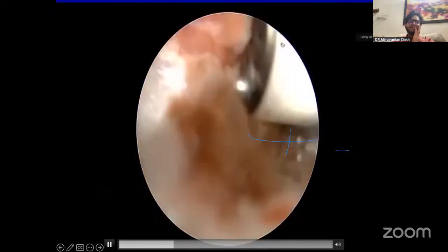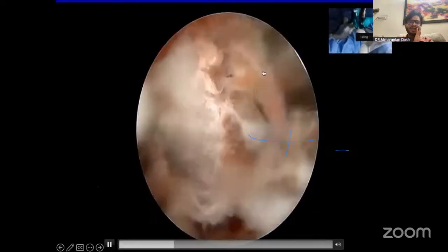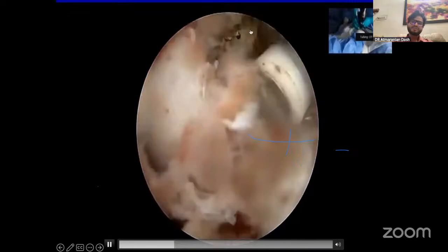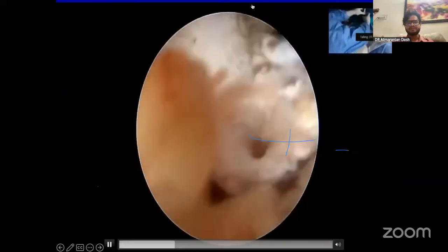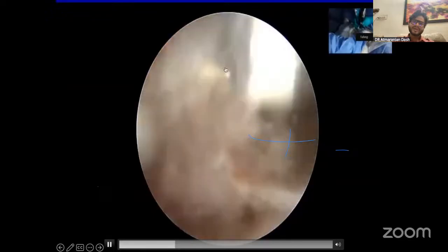So this is the advantage of midline biportal endoscopy, that because it does not have any multifidus muscle medial to the triangulation, you don't feel any poking or hindrance from the multifidus here. We are just medial to the spinal lamina junction. So this is the spinal lamina junction.